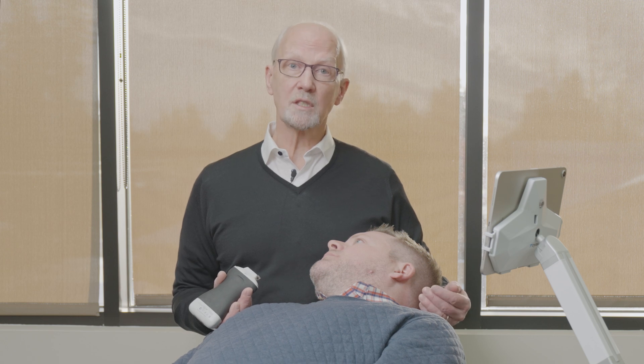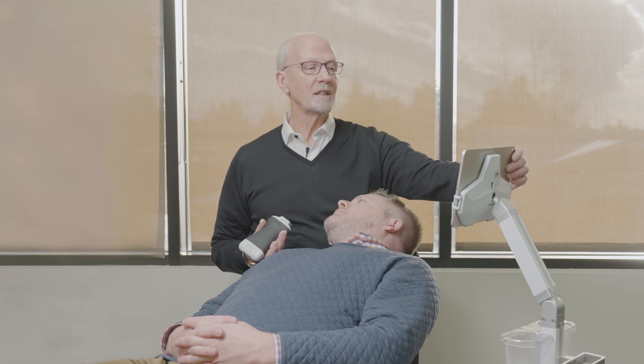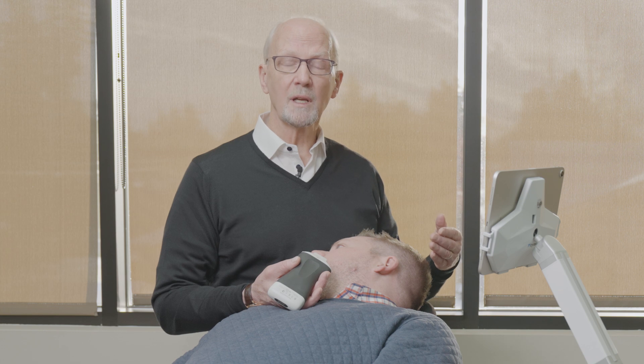It'll help us understand what's going on underneath the skin rather than being able to only interpret what we see on the surface. Normally we would be doing this in the aesthetics mode for the monitor, but we're going to switch this over and do this on the new dermatology mode — it just makes it much easier. We'll also be using our voice-activated and voice-controlled software, which will help us control the instrument, especially useful when we're working alone.